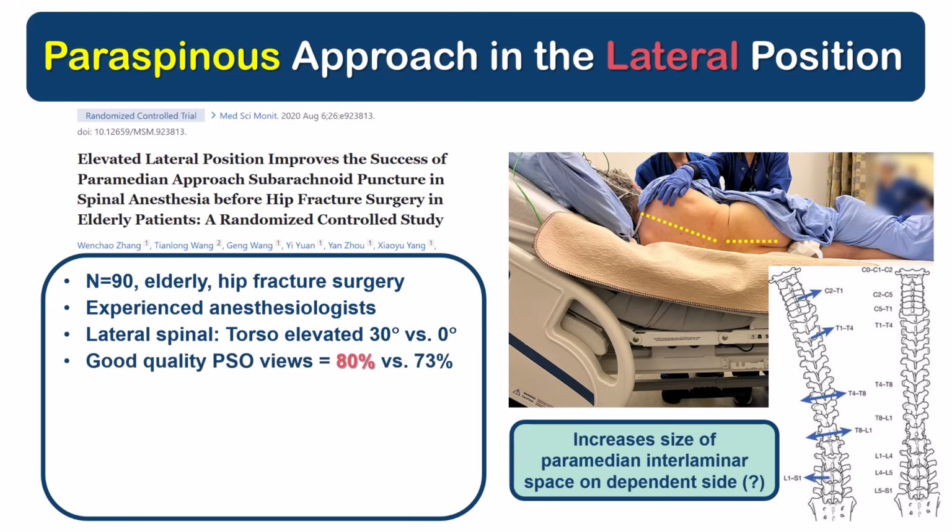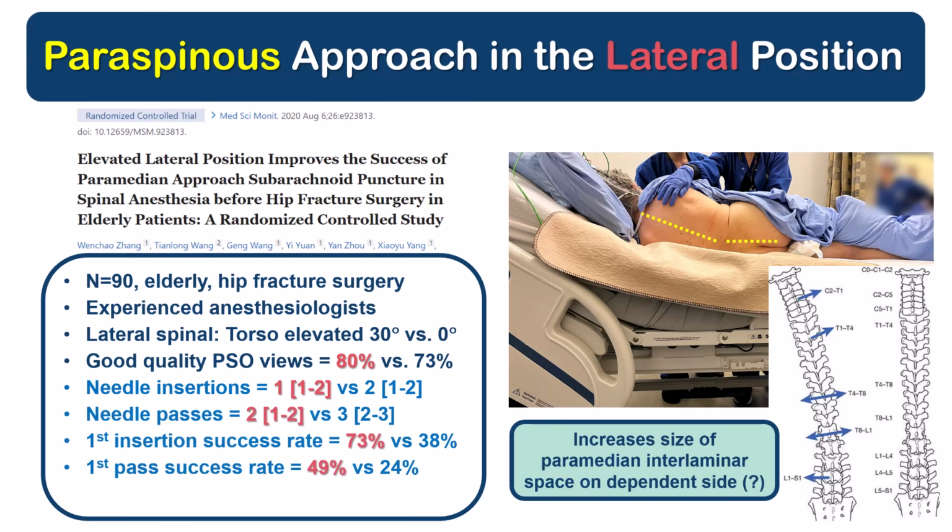But returning to the study, they assessed and marked the interlaminar spaces with ultrasound, and although there was no significant difference in the quality of PSO scans, it wasn't powered for this. And you could argue that there is perhaps a trend to better views with the flexion. Most importantly, however, they found that this elevated position was associated with reduced technical difficulty based on several metrics of needle insertion and redirections. Patients also reported lower discomfort scores for the whole procedure.